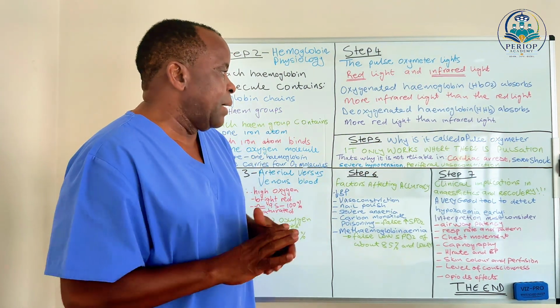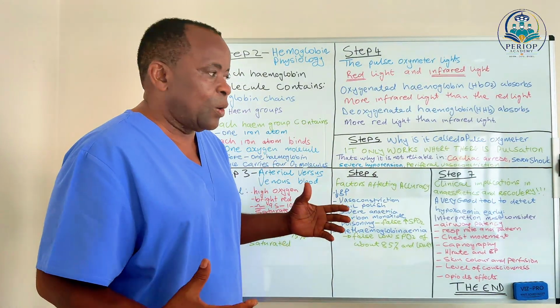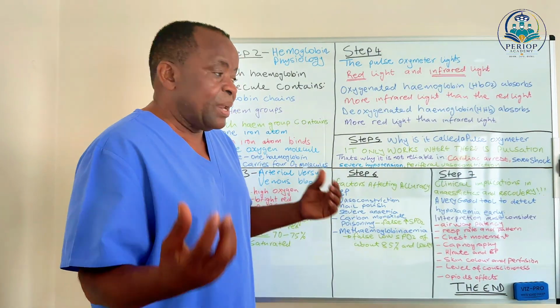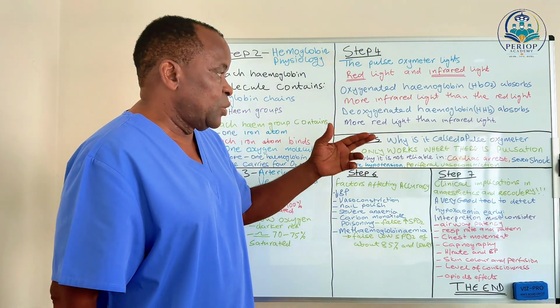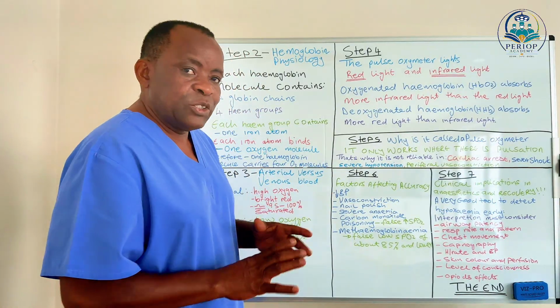it is not a reliable gadget in cardiac arrest, because the heart is already stopped or is stopping or is struggling. We want to revive it, and the peripheral perfusion is not there, pulsation is not there, so this is not a reliable gadget to use. In severe shock, we are not using it. Why?